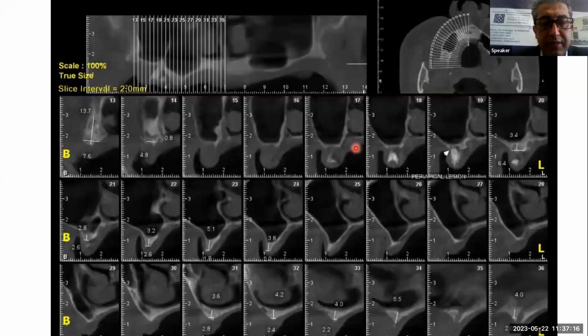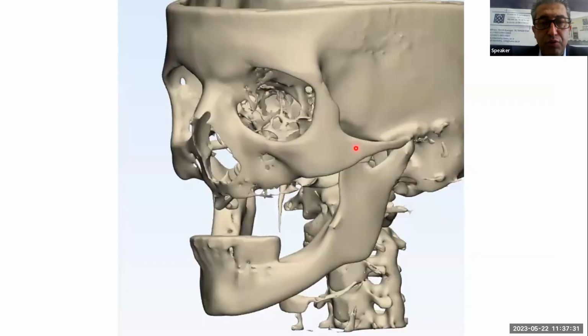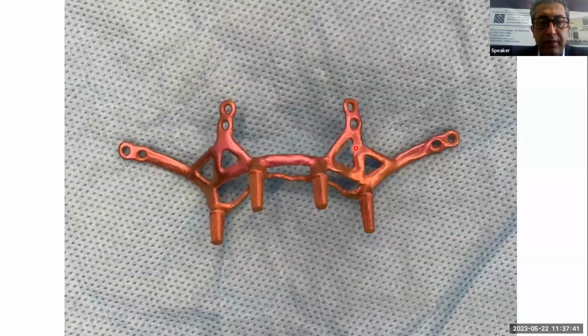The third case is a young lady with a story of severe maxillary atrophic ridge. Also, she refused to do iliac graft surgery and sinus lifting. We also designed a subperiosteal implant for the upper jaw. After assessing the CBCT, we designed this kind of subperiosteal implant with fixed abutments. And after designing, we fabricated it and did anodizing to change the color to pink.